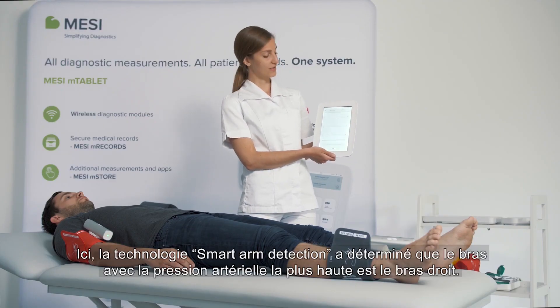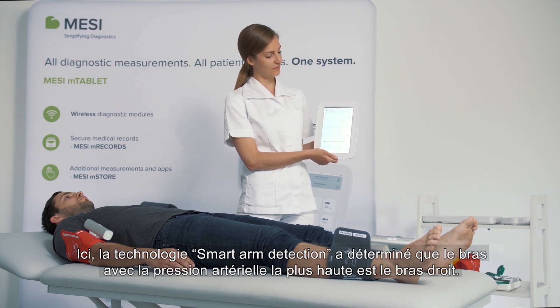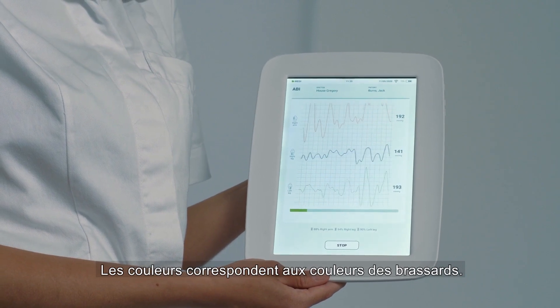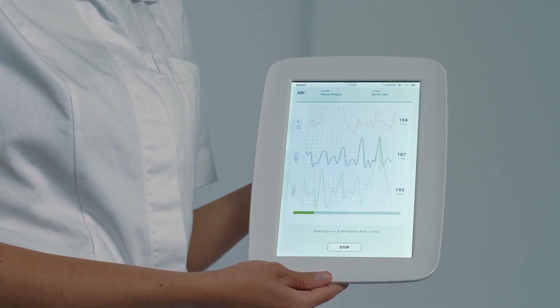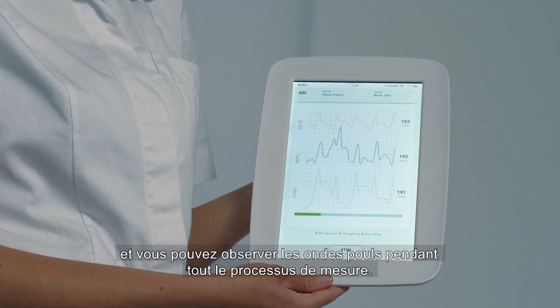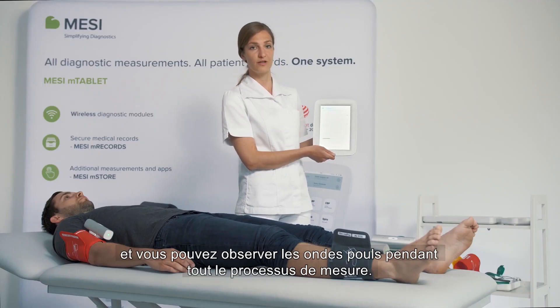The smart arm detection determines that the arm with the higher blood pressure is the right arm, and all the colors correspond to the color of the cuffs. After a couple of seconds, the pressures level out and you can monitor the pulse waveforms for the entire measurement.